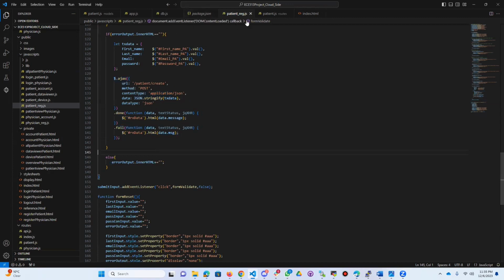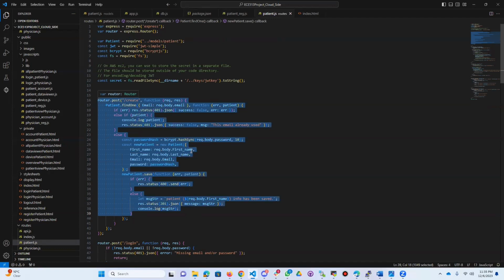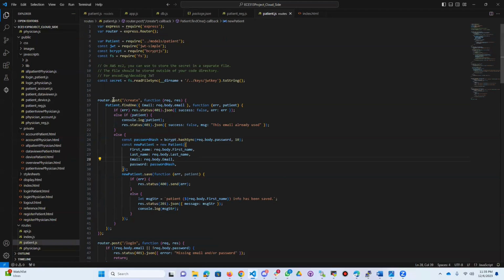So yeah, and then if we move to the routes again, I have already opened it. If you see here, it's patient.js in routes. And here, one thing we have to see is the POST request. Actually, here you can see the POST request.